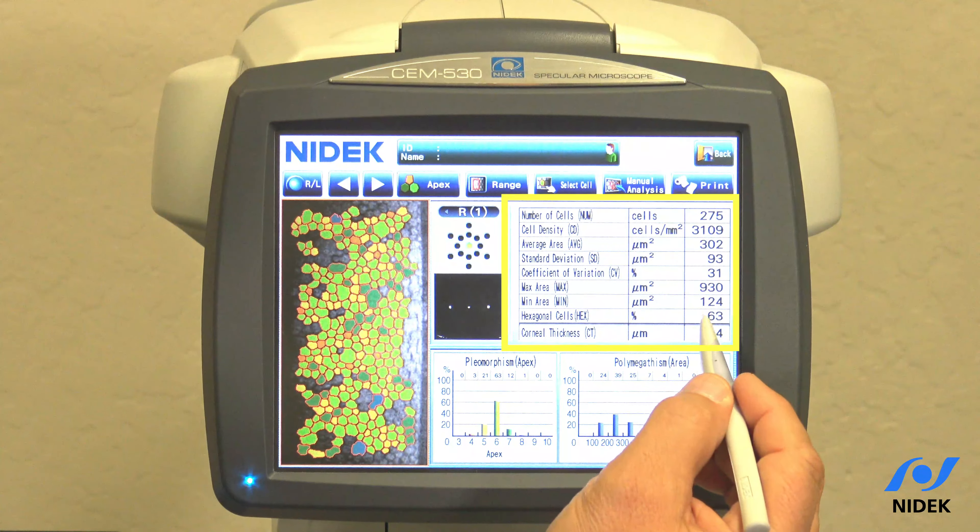Once you're complete with analyzing, we can go right into print and print the results.